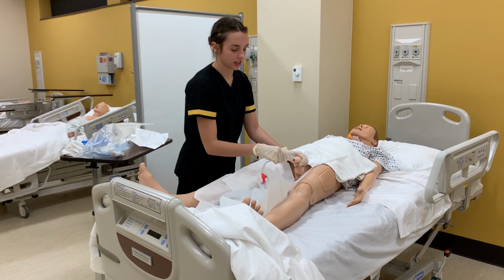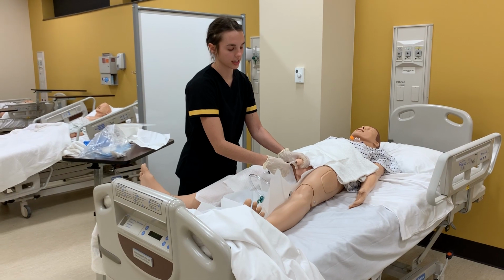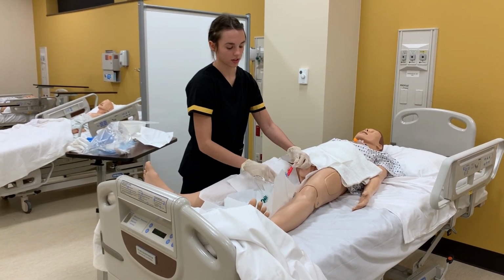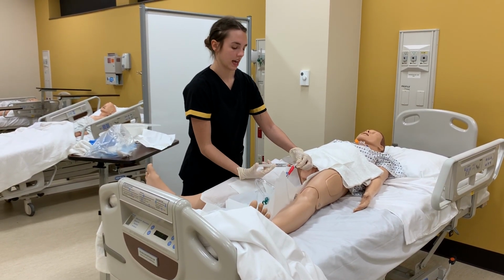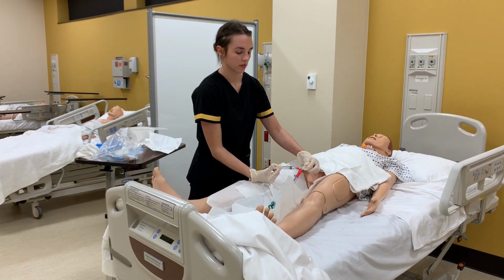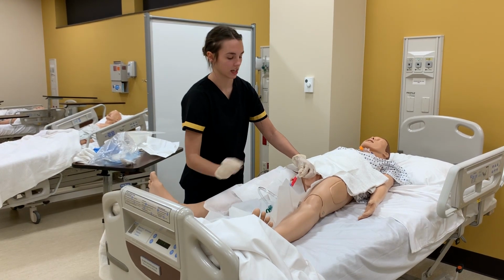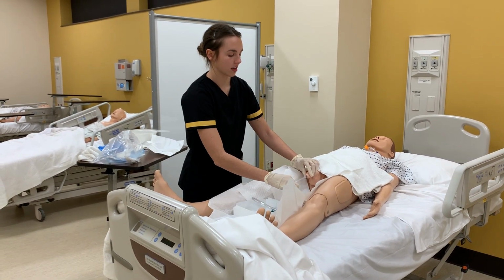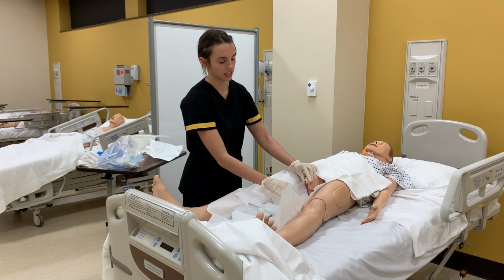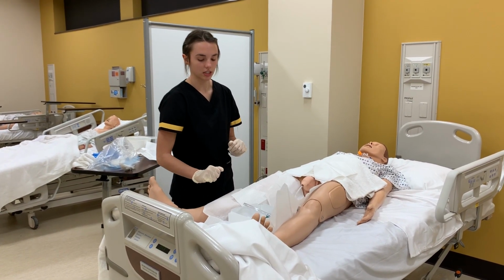And for males, you insert all the way into the Y port, just like this. And then you hold it with your hand and inflate the balloon. And once you have the balloon inflated, you can pull back until you feel some resistance. That means it's in place, the balloon is in the bladder, everything is ready to go.